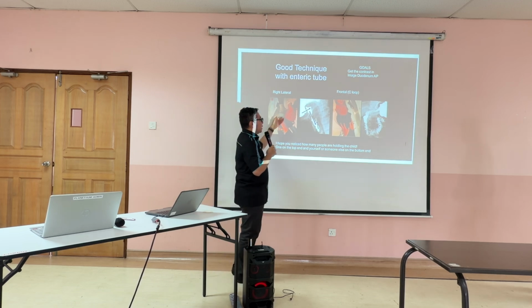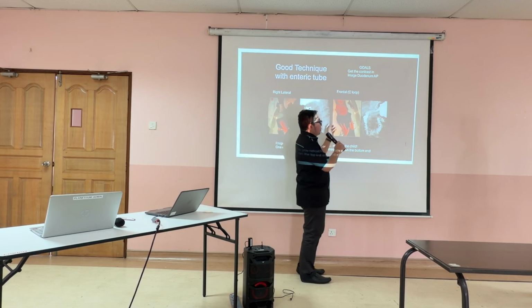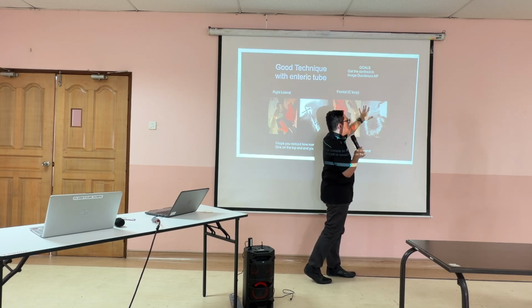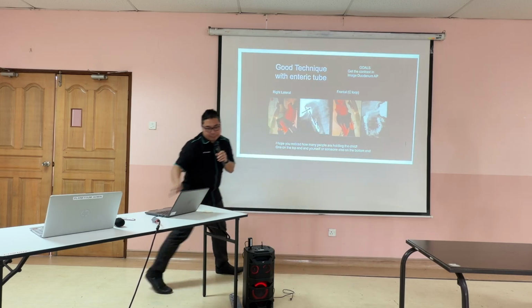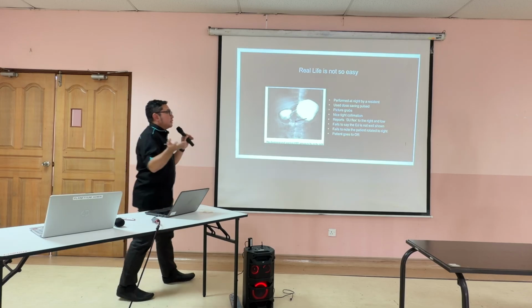When we put the patient in the lateral side, we follow the contrast and everything. Then the problem is when you need to turn the patient very quickly to make sure the contrast is moving to the left. This is the problem, because you want to maintain the position or the patient is not moving. So real life is not easy.